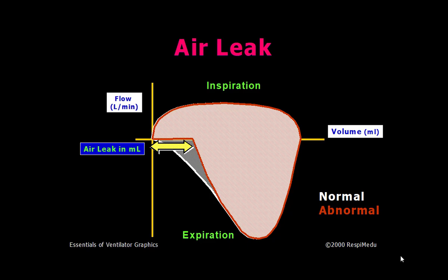Air leak is a volume phenomenon. So the volume does not reach the baseline. The volume does not reach back to the FRC, it stops somewhere before. So what went in, something else came out. So there is something which has leaked.